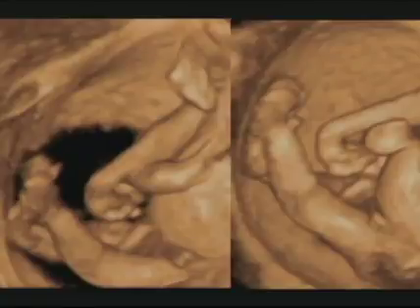And in this case, this fetus, who has arthrogryposis, has some contractures of the upper and the lower extremities. You can see that the fetus has hyperextension at the knee and club feet. You can see that better on this side. And you can also see the clubbed hand or the clenched hand because of the contractures, and this fetus is not moving at all.